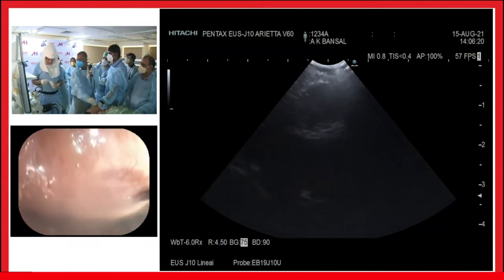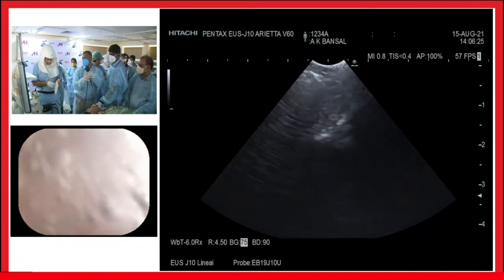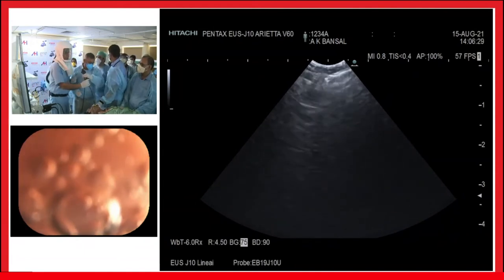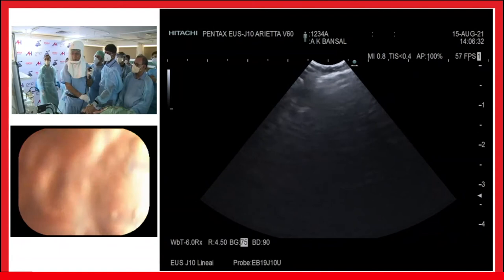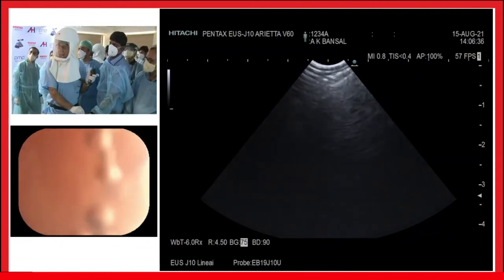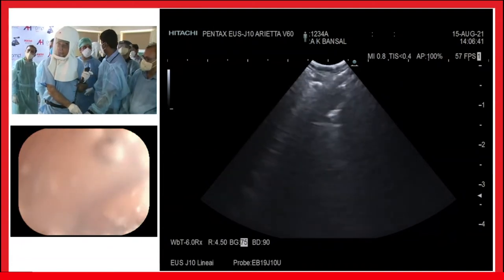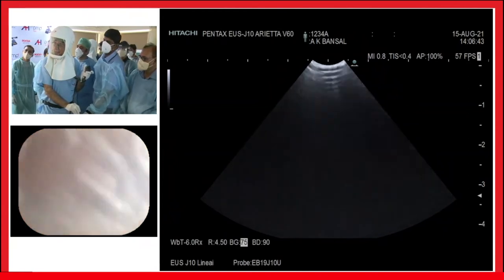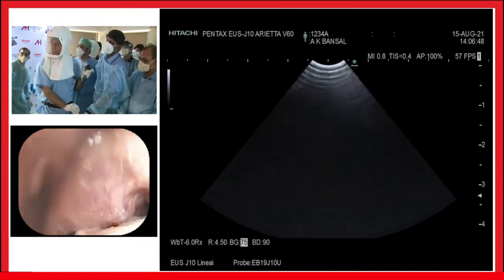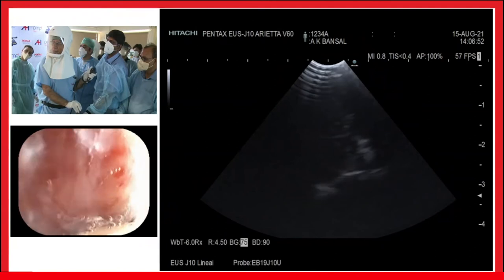Yes, sir. You want to demonstrate the anatomy? Can I also try and demonstrate the anatomy a little bit? Yes, sir. Okay, because people are no longer that interested in FNAC now. So I will start again. I don't know how to enter the bronchus, but I will just manage. I'm in the trachea still? Yes, sir, but I'm deep down, now in the lower end of the trachea.